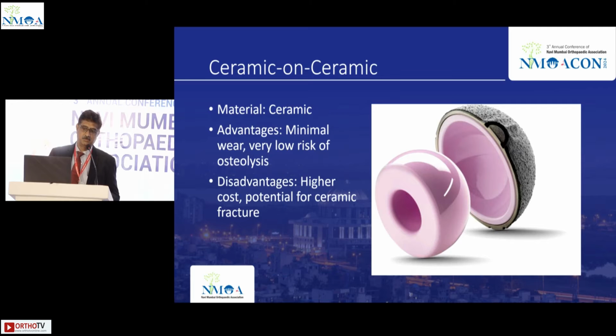Another component available is ceramic on ceramic. Advantages are minimal wear and a very low risk of osteolysis. Disadvantages are higher cost and the potential for ceramic fractures.